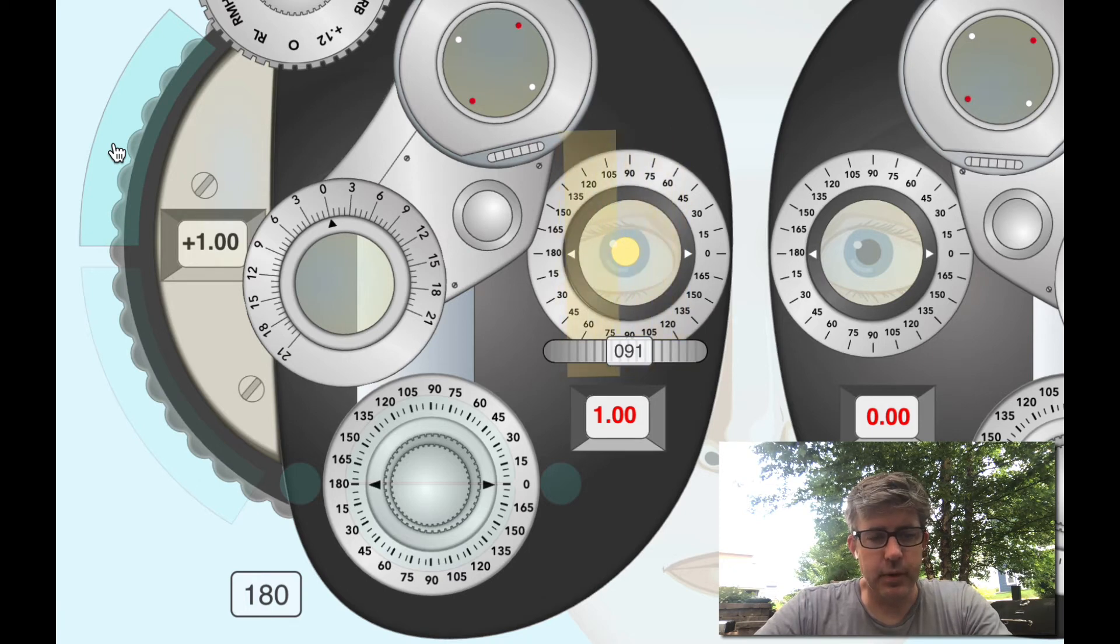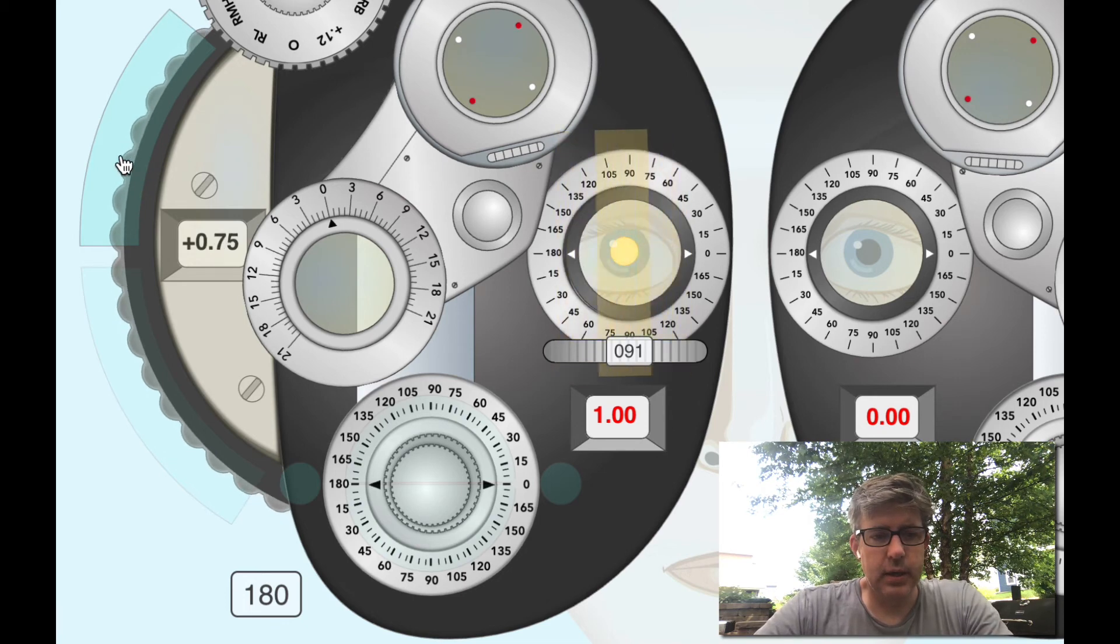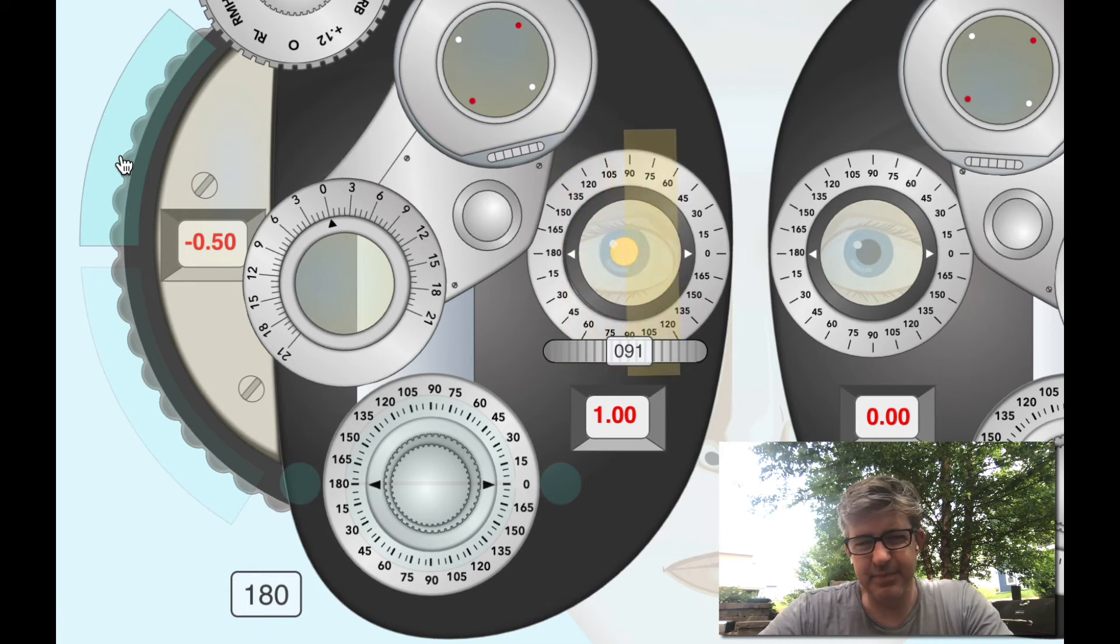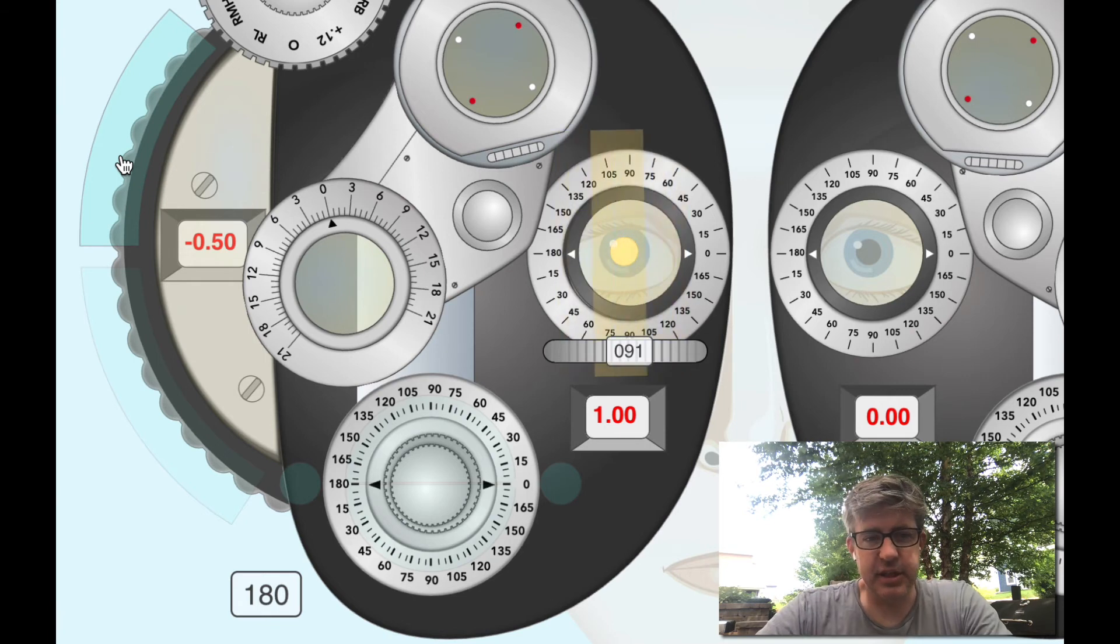That's what I want. So if my habit is to finish retinoscopy and go one, two, three, four, five, six, then I don't have to do any math, which isn't hard but I don't have to do it. I don't have to potentially make a mistake. Usually what I'm going to do in this case is do retinoscopy on both eyes and then refract this patient. It's nice to have their distance power in the instrument right off the bat.